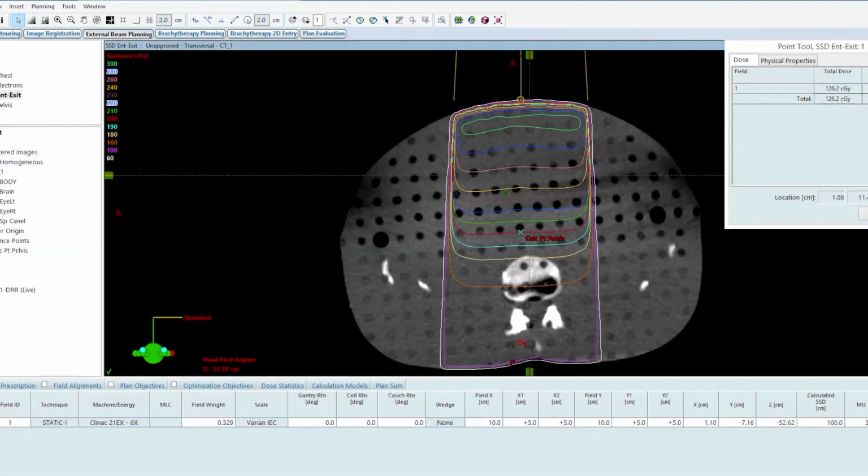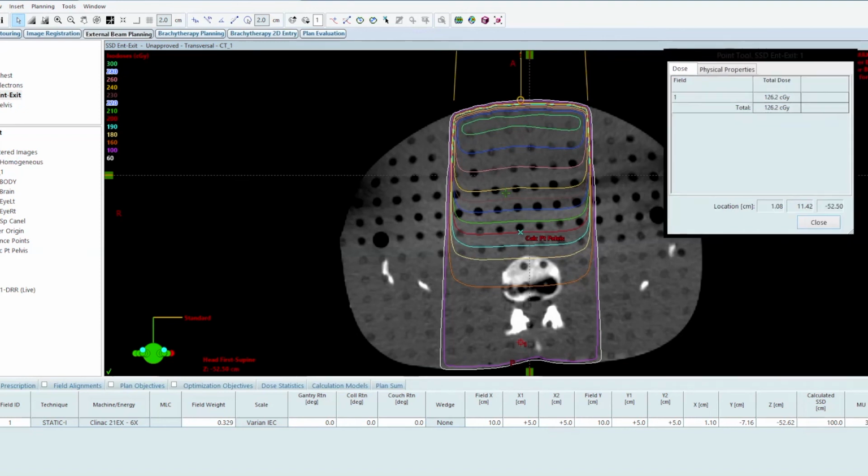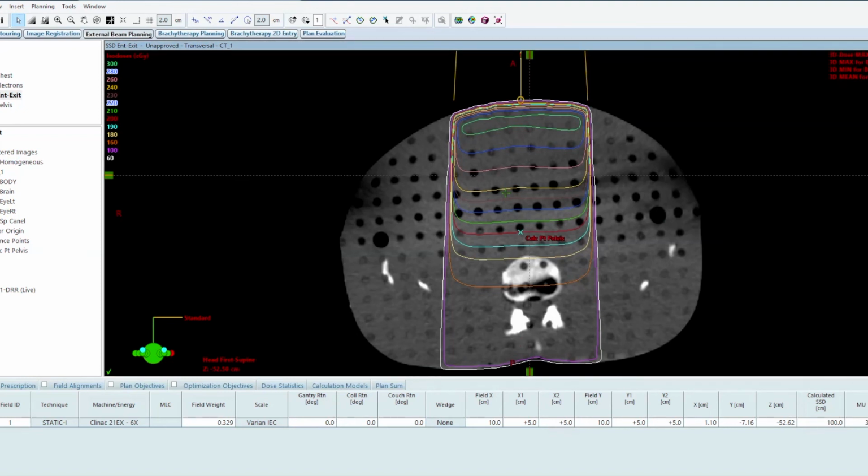It's the one-step method, which I think is shown in the other podcast, instead of the two-step method where you find dose at Dmax and then you apply a percent depth dose to take you to dose down at the exit point. This can be useful for single SSD fields for calculating entrance dose, if you want to find out what your Dmax, maximum dose is within the body. Otherwise, your exit dose, maybe if you have spinal cord or something like that that you're worried about. Okay, that is it.